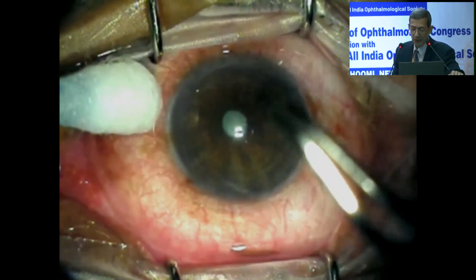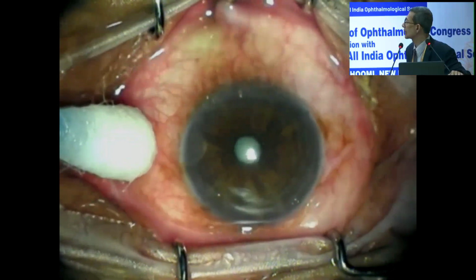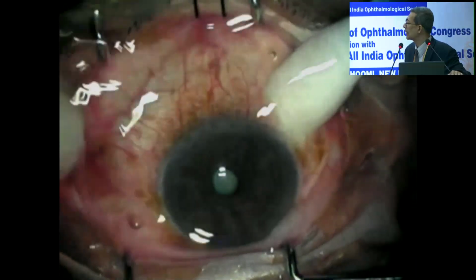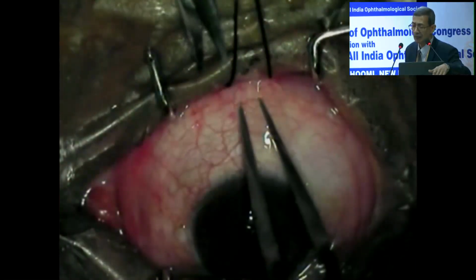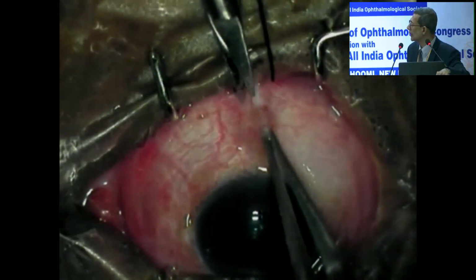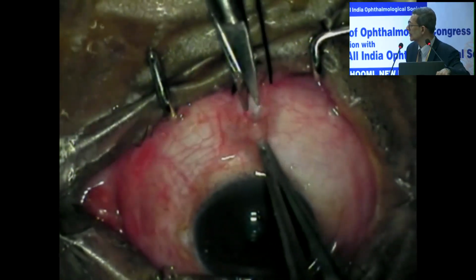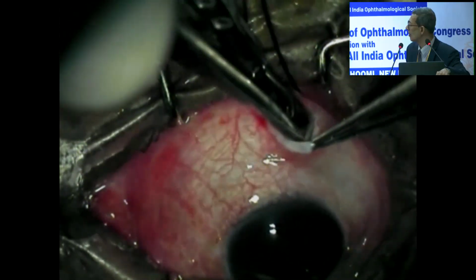What we are seeing here is that the superior rectus traction suture is given. One can give a corneal traction suture, and the eye surface should be washed thoroughly before we incise the conjunctiva and perform the subsequent steps. Here I am showing a limbus-based conjunctival flap. Tenon's and conjunctiva are dissected in a single layer, and the dissection is carried out on each side.